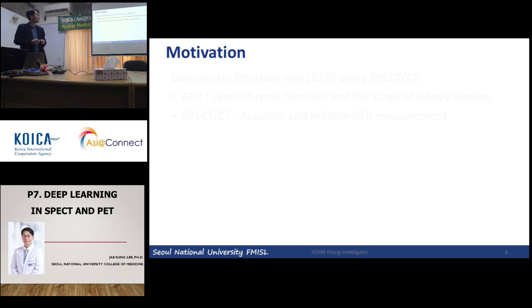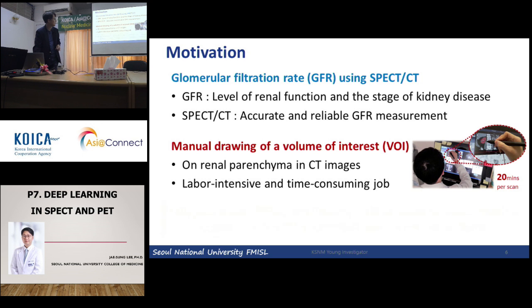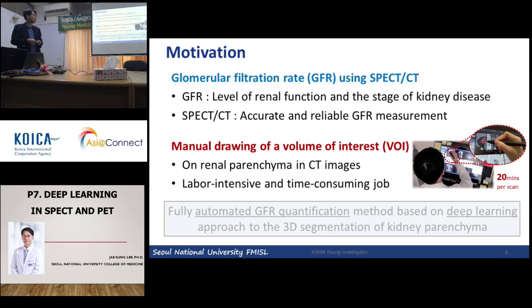That is why we decided to develop some deep learning technology that can replace the human expert in drawing the three-dimensional volume of interest onto the kidney parenchyma. If it is successful, I think it will be quite useful to reduce the human effort for this kind of quantitative SPECT/CT.